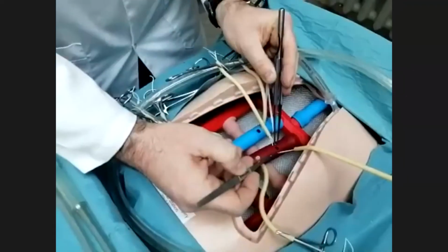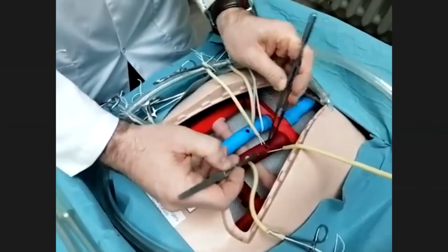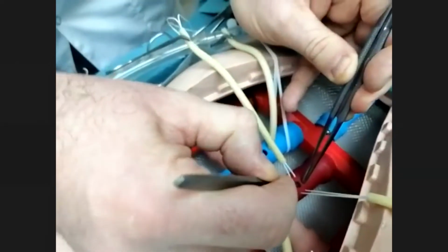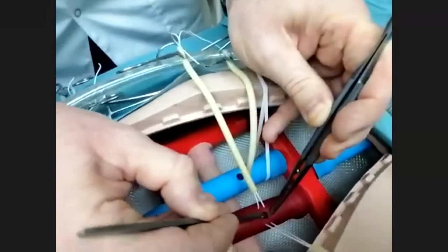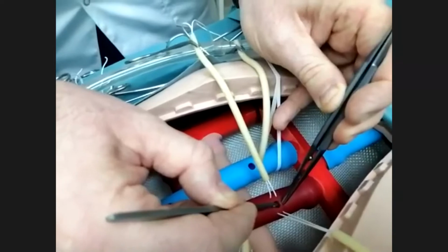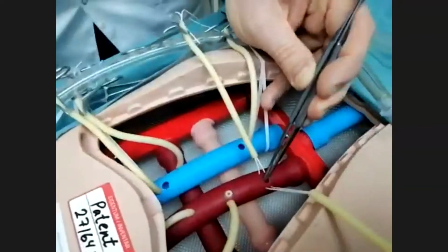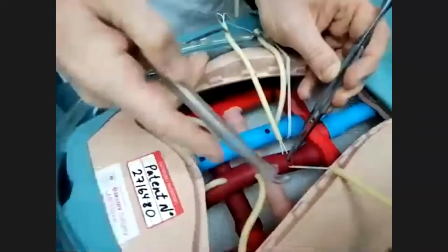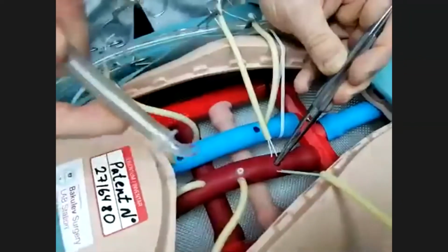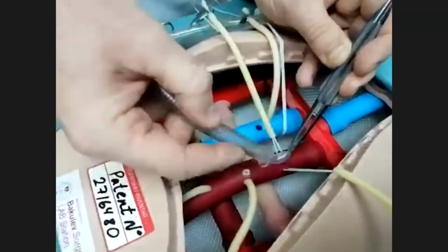We take the superficial layer of the aorta, and then we put the scalpel through the aorta. Then we close the hole just like this for the upper layer. Then I take my cannula in my right hand, and we have many different techniques of insertion of the cannula.